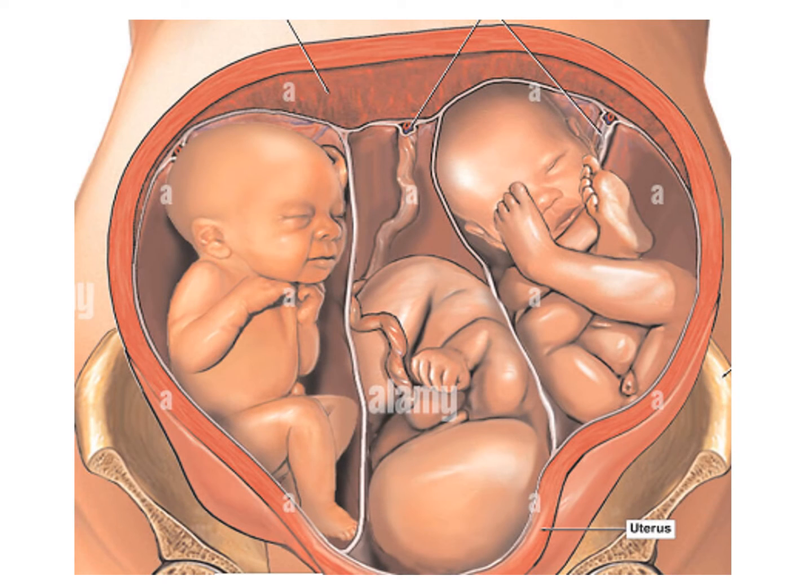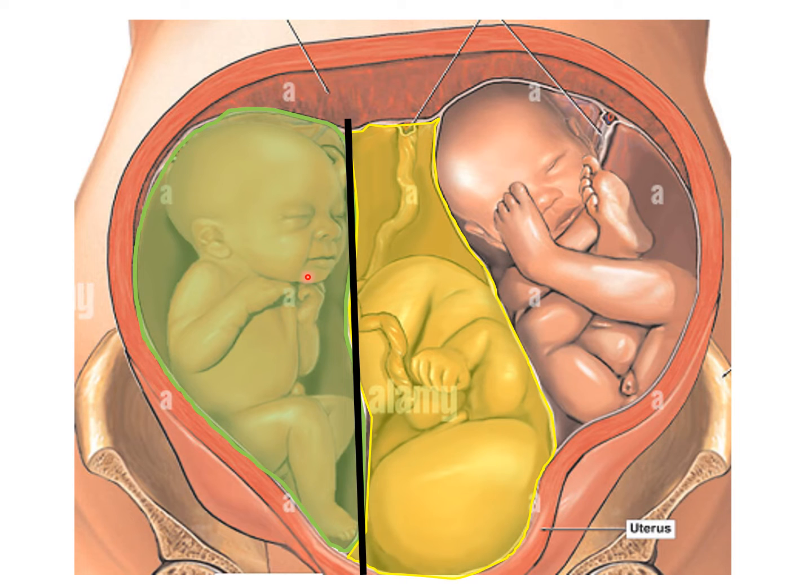Now, indeed, the most challenging aspect of scanning multiples is when we're scanning more than 2 fetuses at a time. And so in this case, this is triplets. And the challenge comes from having less room to scan and isolate each of these fetuses.